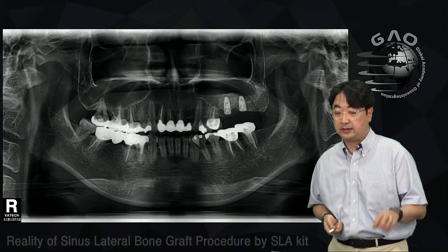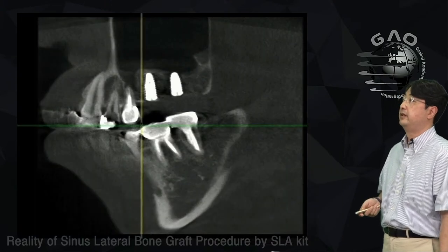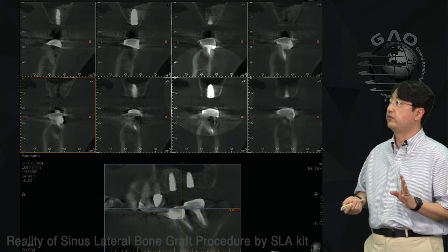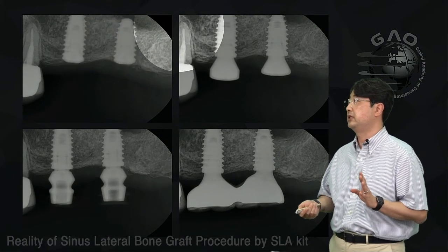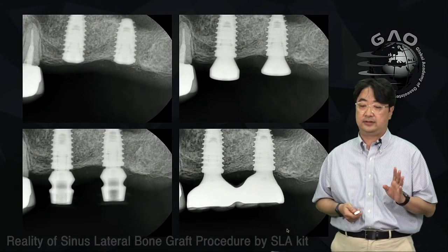Then I did the implant placement, and this is how it looked in the periapical radiograph. And this is the cut-off CT scan. Also, from the CT scan, you can see the bone graft around the implant, right? And again, these are the periapical pictures from implant placement, uncovery, impression making, and final restoration.